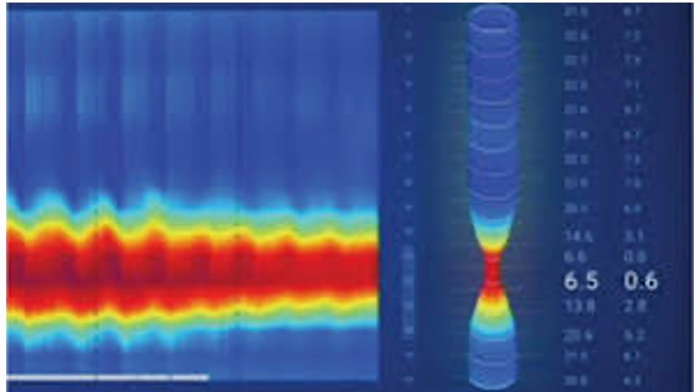The wave-like oscillations suggest contractile activity or secondary peristaltic contractions, which are RACs or RRCs. The right panel is an hourglass image, which is the most important part. The balloon shows an hourglass narrowing at the center, which corresponds to the esophagogastric junction. The upper balloon is the distal esophagus, the narrow waist is the EGJ, and the lower balloon is the stomach.